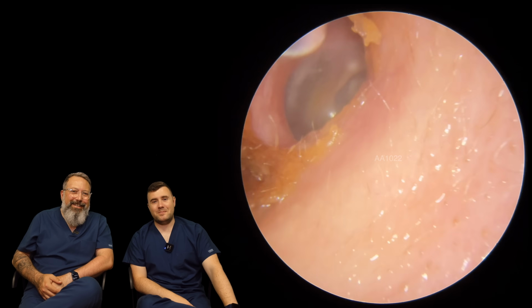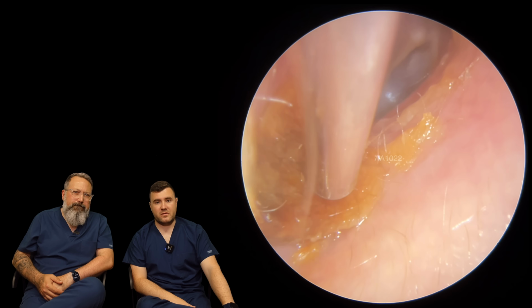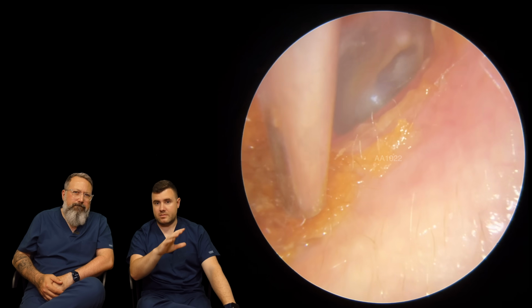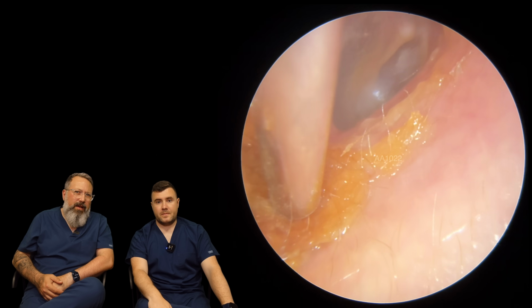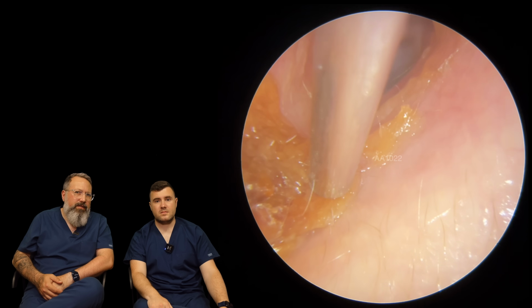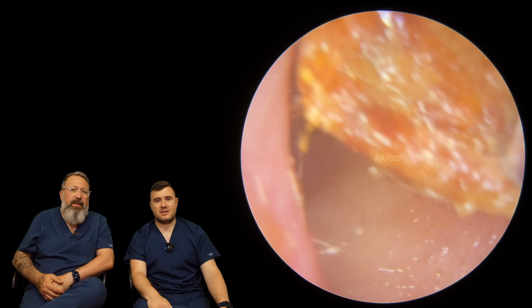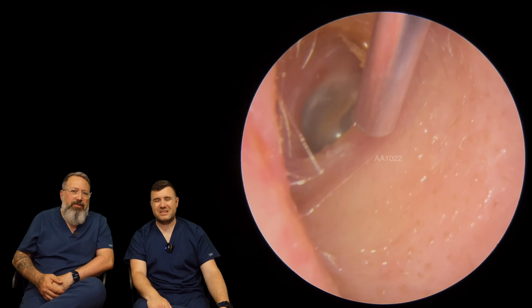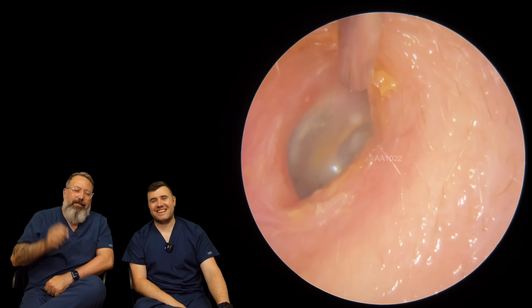A little bit left now at the entrance. Still sticking with the fine end. The patient's already hearing so much better because we've got a clear view down to the eardrum there. This is probably the most difficult bit to get away without causing any discomfort, this particular section rather than the other one. Oh, nice. Perfect suction tube handle. I think that's exactly the spot. There we go. Out it comes.